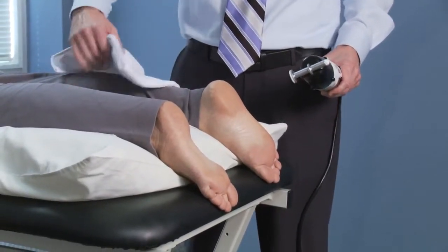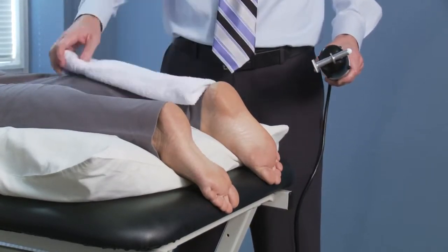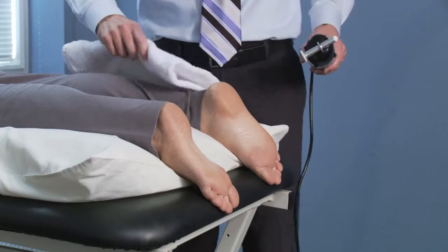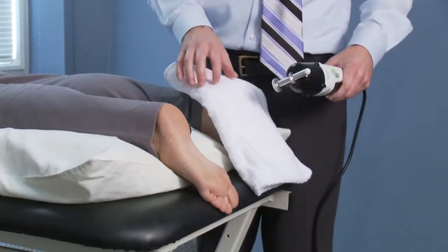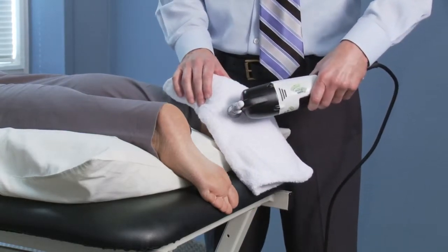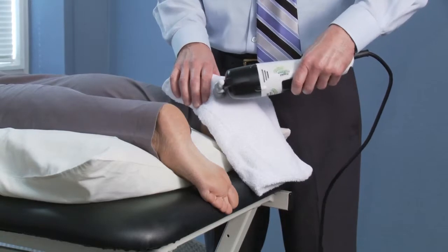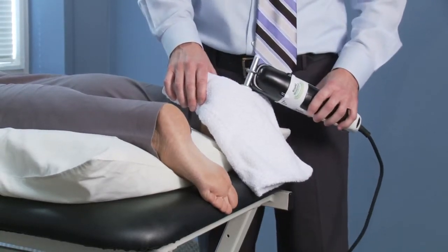So I often will have a towel. I'll start using a towel and then if the patient's sensitivity is okay, we will move away from the towel. Just covering the foot, I will kind of circle the heel first and come in using the very edge of the trumpet head with small circular strokes to kind of desensitize the foot.